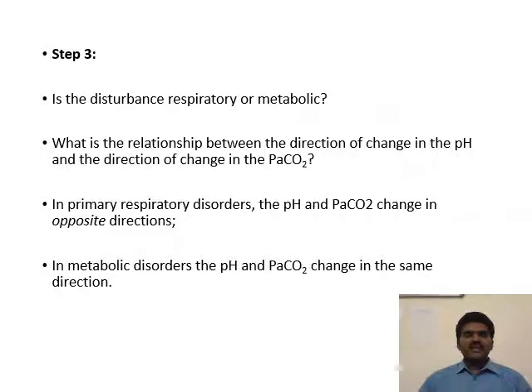Step 3: find out whether the disturbance is respiratory or metabolic. For doing this, you need to check the relationship between PaCO2 and the pH. In primary respiratory disorders, the pH and PaCO2 change in opposite directions. In primary metabolic disorders, pH and PaCO2 change in the same direction.